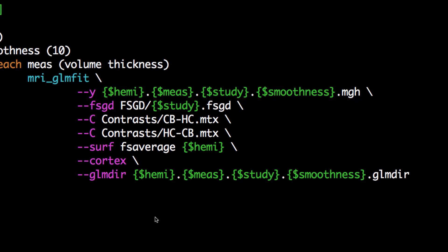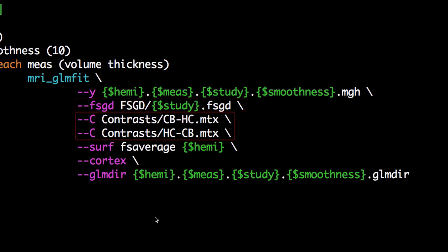The FSGD file specifies which class corresponds to which subject, and the contrast files make contrast maps and calculate the significance of the contrast at each vertex. Here, we've only specified two contrast files, but you can make as many as you like.